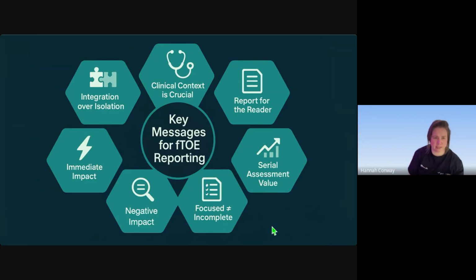And negative findings, what I mean by that is that it's important to report normal findings, okay? Because you're going to have a high proportion of normal scans in your logbook, not excessively, but you still will. And we as examiners need to know what measurements correlate with normal. So that's important to consider when you're getting your logbook ready for examination.